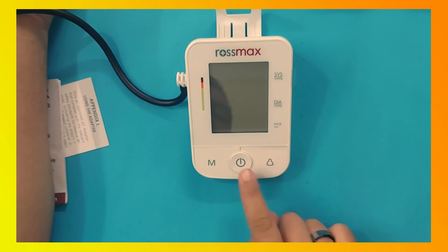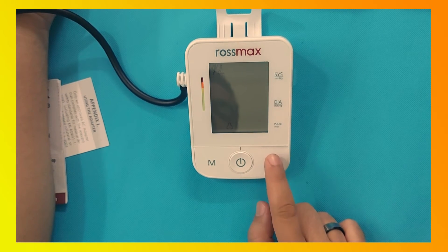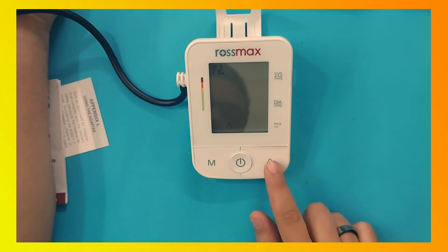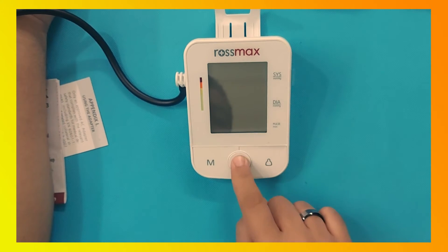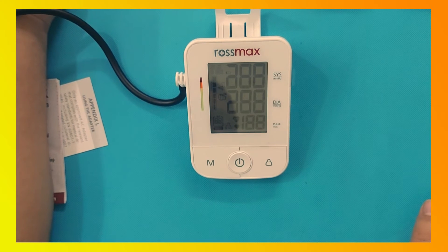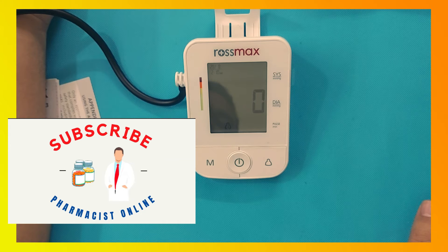Turn on the device and select the user. This device supports two users — User 1 and User 2 — and saves memory separately. There is also a Guest mode. For now, we will select Guest mode. In Guest mode, the device does not save BP readings in memory.